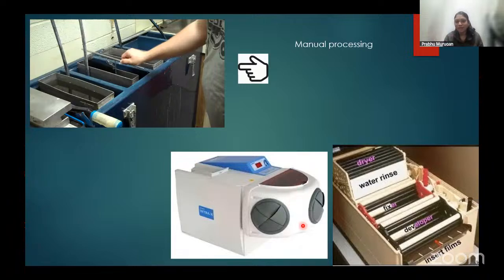You should not open the film and then place it inside. It is going to be exposed to white light. You have to open the packet within this box only, under this red color filter, so that it doesn't get pre-exposed, and then you'll be placing it over a rack. So this is how it will be. This is the place where you'll insert the X-ray film, and it'll have multiple racks. It'll be moving, like a roller.